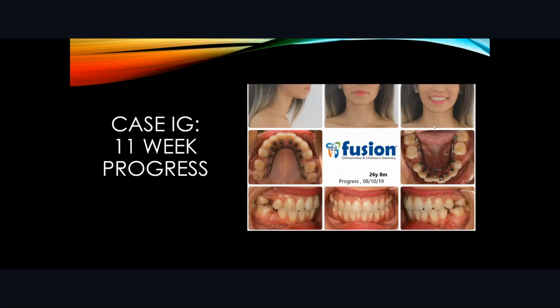One thing you want to notice about independent tooth movement is that each tooth has its own agenda. For example, this patient came with straight lower teeth before we started the treatment. Now suddenly she has crowding in the bottom. That crowding is not a sign of round tripping. That crowding is caused by the fact that all these teeth are moving towards their final destination, which is much more upright than what they were originally. But some move faster and some move slower.